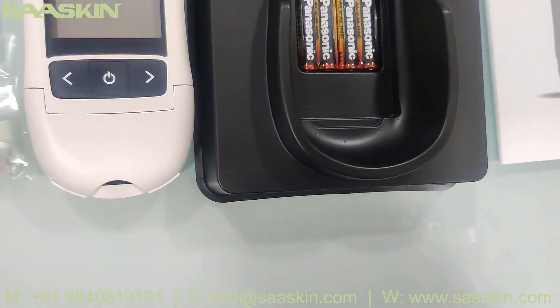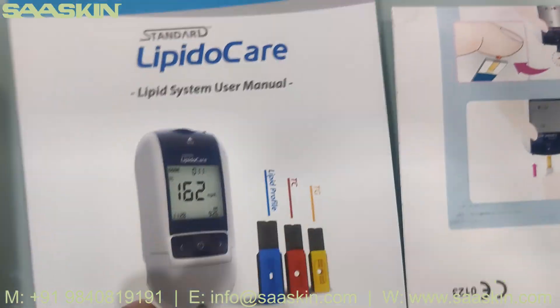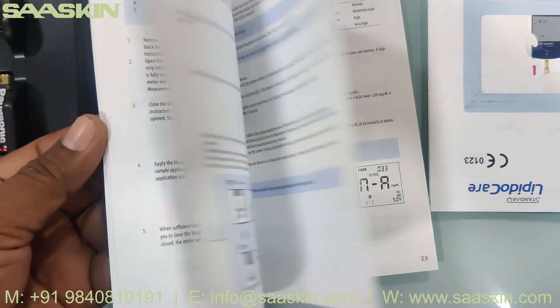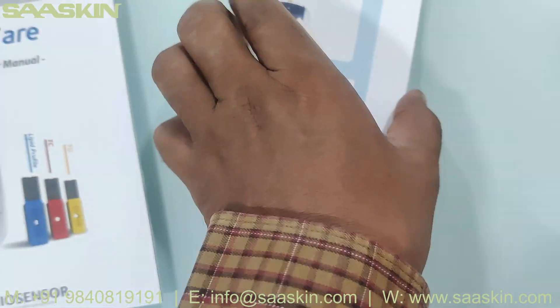You have to load this strip here and then insert it into the analyzer. You also get a lipid system user manual — there is one detailed manual available, a complete instruction manual, and along with that there is also a quick guide.